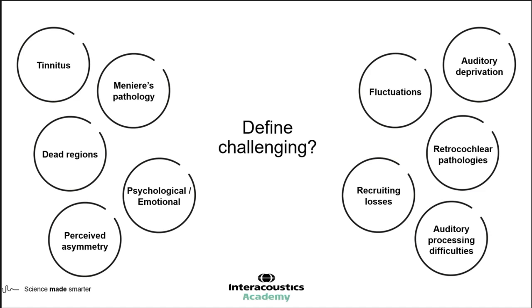I actually asked around some colleagues when I was preparing this webinar, and a really popular topic was patients who've experienced significant auditory deprivation, and trying to rehabilitate them. People were telling me they found this really challenging, probably the most difficult of all. Auditory processing difficulties, whether secondary to a hearing loss or in isolation, can be very difficult cases to manage. And I've also put perceived asymmetry on the screen here because it's not always about the audiological profile in terms of the audiogram, but actually what a patient is experiencing can be quite different. And we'll go into a bit more detail about that later.